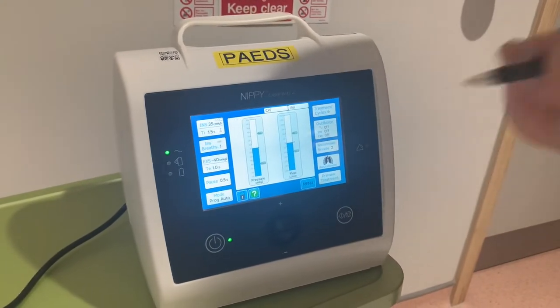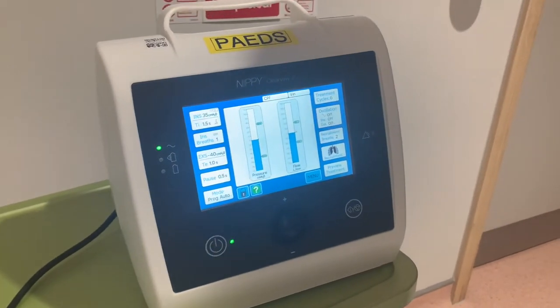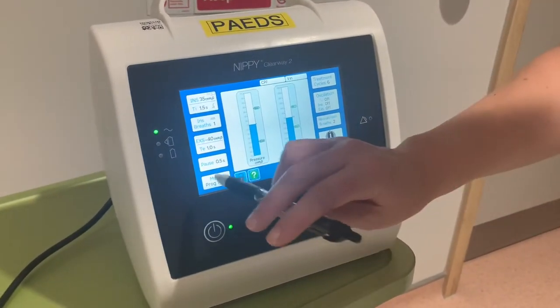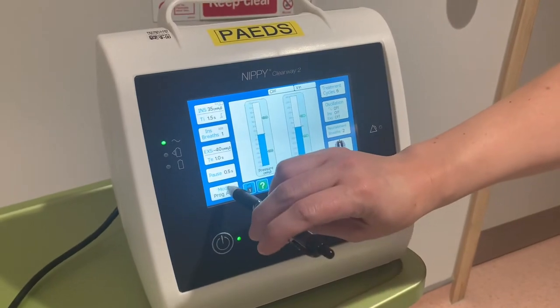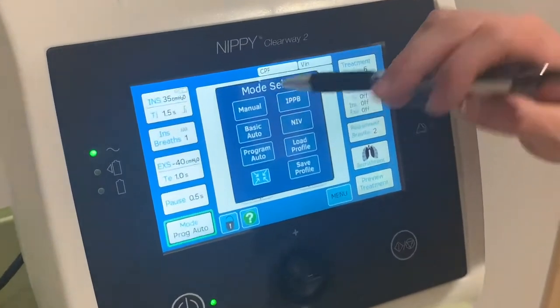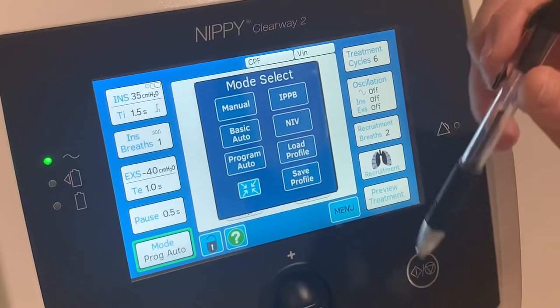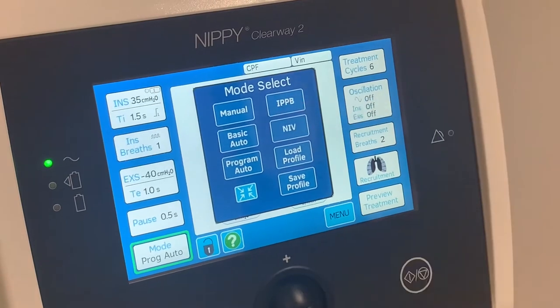For on-call purposes, there are different modes shown in the bottom section of the screen. We have manual mode, where you can manually give the inspirations and expirations, and basic auto, which gives you 20 breaths in and out — we won't be using that today.